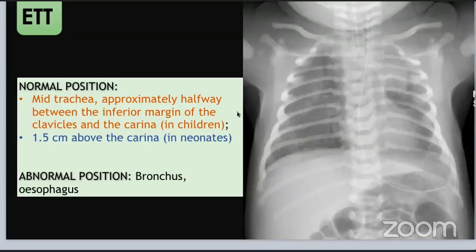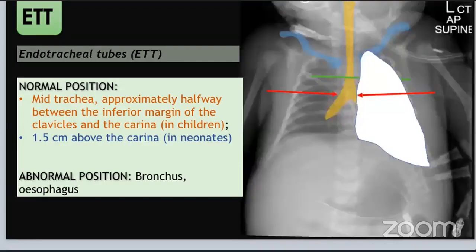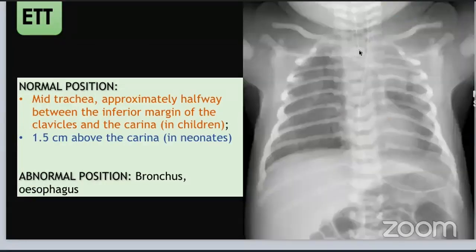This is the next case for the endotracheal tube. Here, this is the tip of the endotracheal tube.